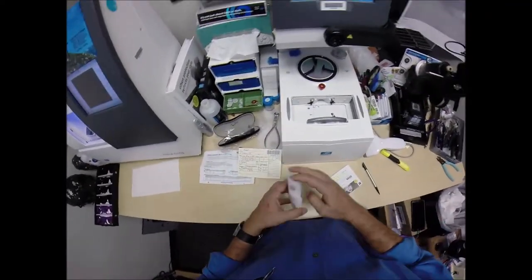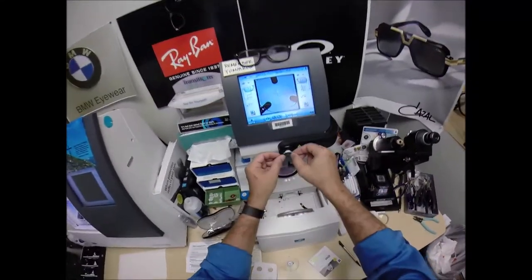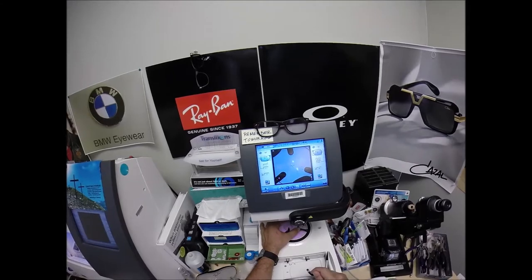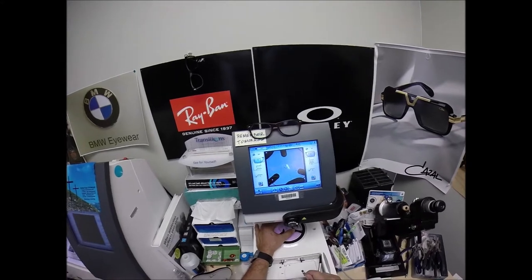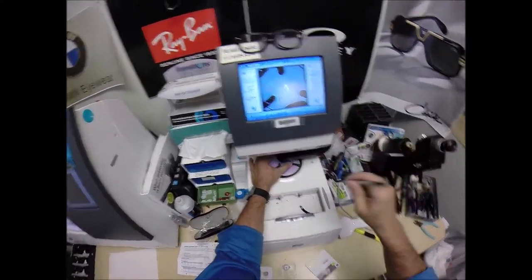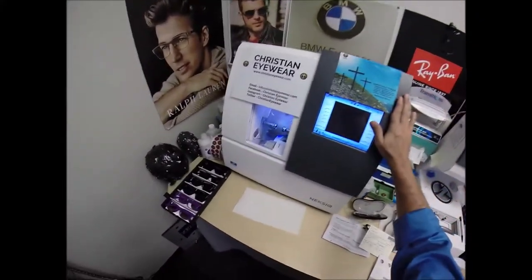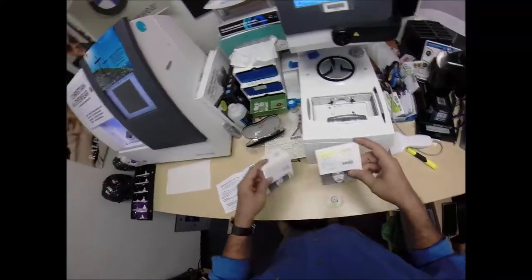I'm going to take the left lens out of the packet and place it onto the platform. Pull the paper away to make the black side sticky, line up the magnet. Same pupillary distance, same optical center height. Make sure everything's lined up just perfectly. Now that the block is applied to the left lens — this is the tracer, this is the blocker, and this is what's known as the edger. I'm going to come back to you because this is a start of how Zeiss documents everything that they do.